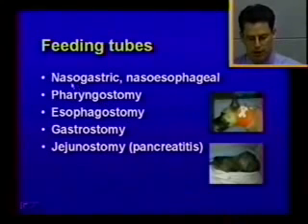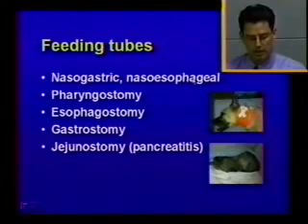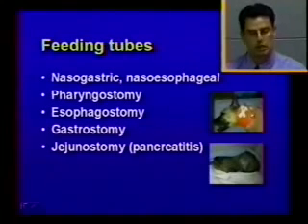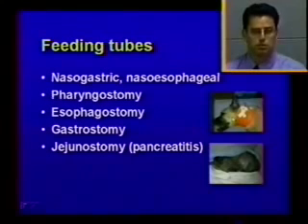Different feeding tubes available. We have the nasogastric feeding tube. We have a nasoesophageal tube, and pharyngostomy tubes, where a hole is made just in the pharyngeal region. And then we have the esophagostomy tubes as pictured here. The hole for the esophagostomy tube is going to be a little bit further caudal than where a pharyngostomy tube would be placed, and this has less incidence of obstruction of the larynx than pharyngostomy tubes do.